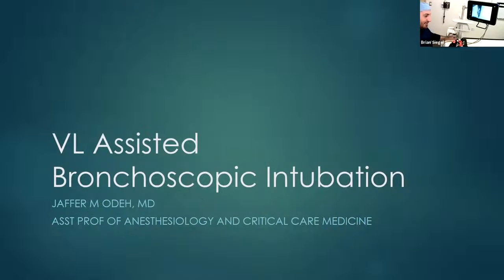Video laryngoscopy assisted bronchoscopic intubation. My name is Jaffer Oda and I practice anesthesiology and anesthesiology critical care. A little note about the title: as anesthesiologists, we're used to calling this fiber optic intubation. We don't really use fiber optic scopes very much anymore, especially with the advent of the new disposable bronchoscopes — hence the title, bronchoscopic intubation.